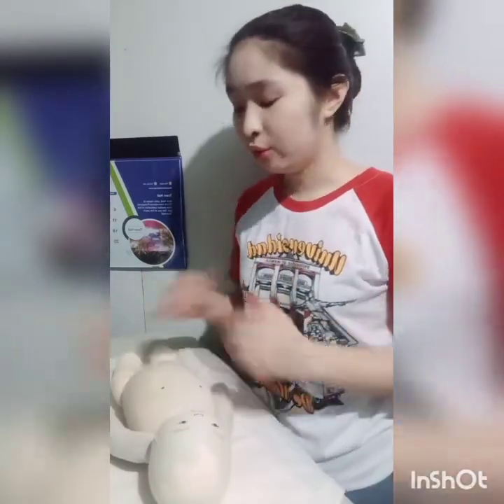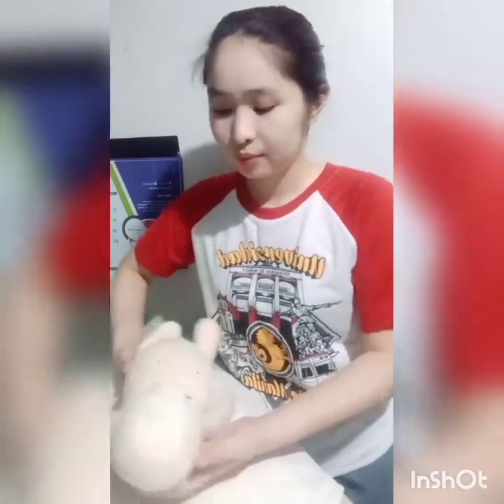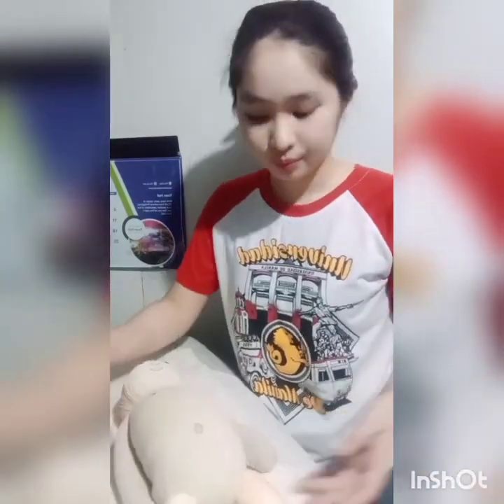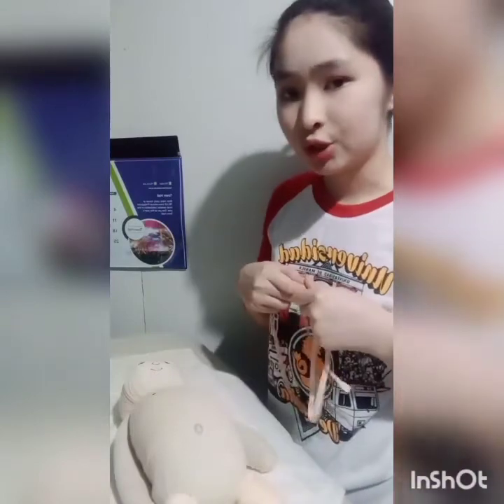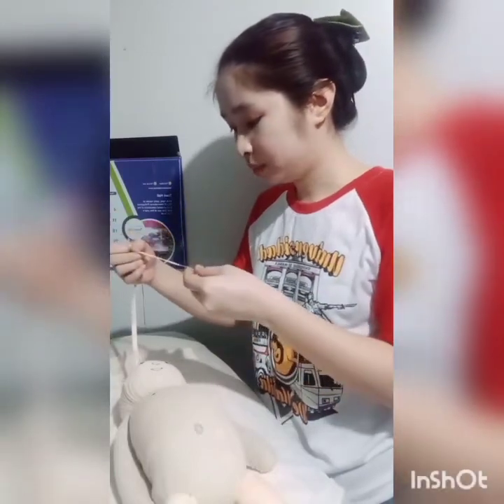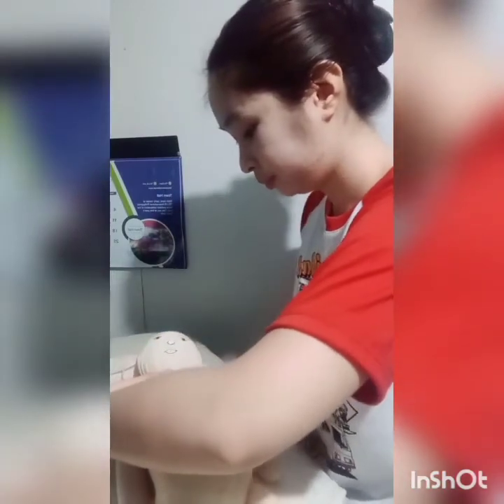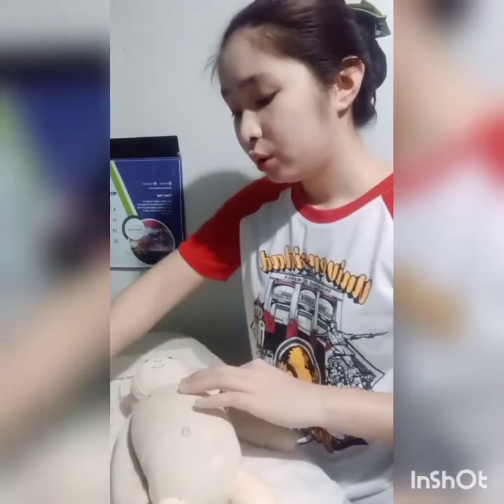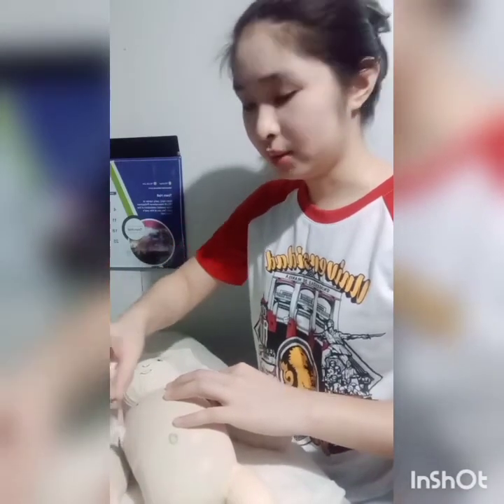So now we're going to move forward in measuring the chest circumference of the baby. To measure the chest circumference, we're going to let the tape measure go under the baby's back, and we're going to pass through over the nipple.